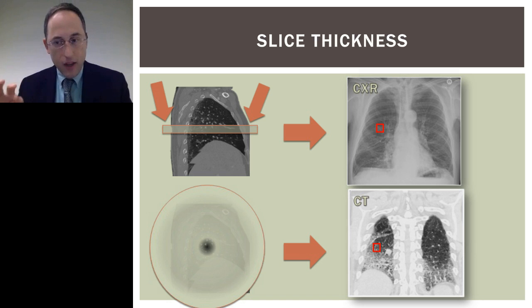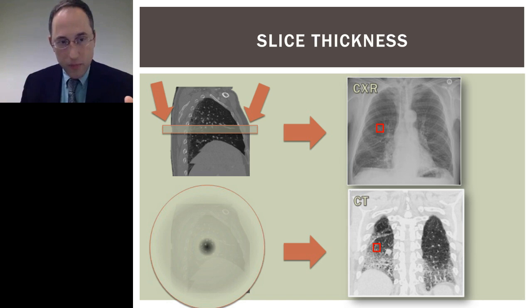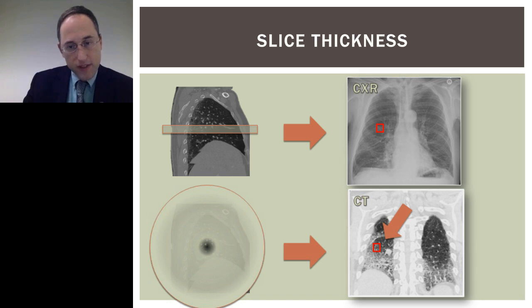And that is the path of the X-rays as it passes through the patient that creates that pixel on the right that I indicated. For CT, it's a little bit different. The question is, what determines the intensity of the pixel in that red box right there?